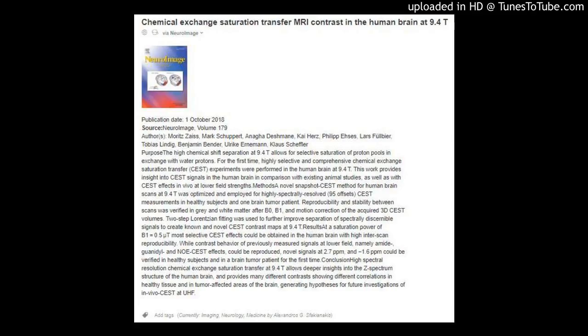Methods: The novel snapshot CEST method for human brain scans at 9.4T was optimized and employed for highly spectrally resolved — 95 offsets — CEST measurements in healthy subjects and one brain tumor patient. Reproducibility and stability between scans was verified in gray and white matter after B0, B1, and motion correction of the acquired 3D CEST volumes. Two-step Lorentzian fitting was used to further improve separation of spectrally discernible signals to create known and novel CEST contrast maps at 9.4T.